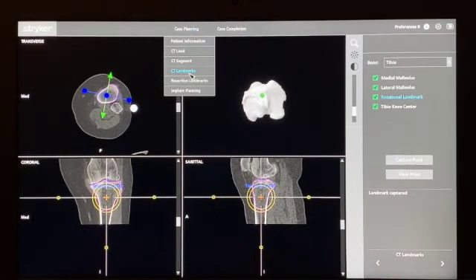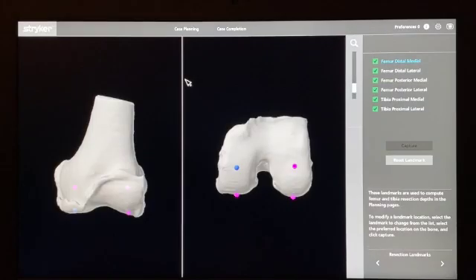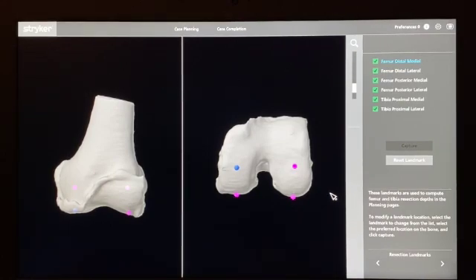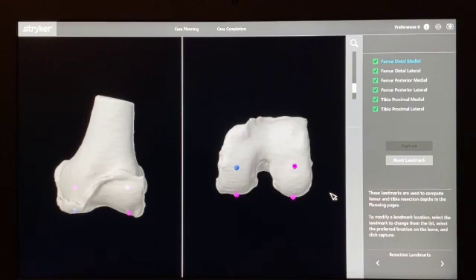Once you've checked your CT landmarks, it's also important to have a look at the resection landmarks. The Stryker staff are instructed to plot these adjacent to the thickest part of the femoral component, which corresponds to where the pegs are distally, and directly inferior to these on the posterior articular surface. However, these are not always the most distal and most posterior points, and this can affect the readings that you get in your plan.